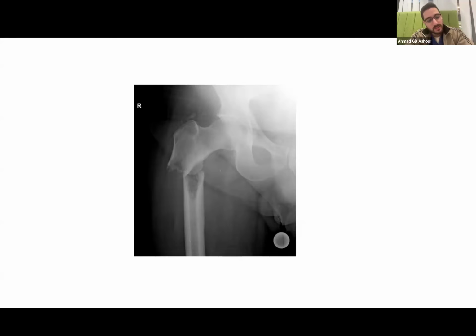Okay, I think you spent 2 minutes or something. This is too long. I know it's a difficult one. I know you wanted to mention everything, but they just wanted an excellent option. Okay. Couple of comments. You said it's minimally displaced. No, this is a displaced one.